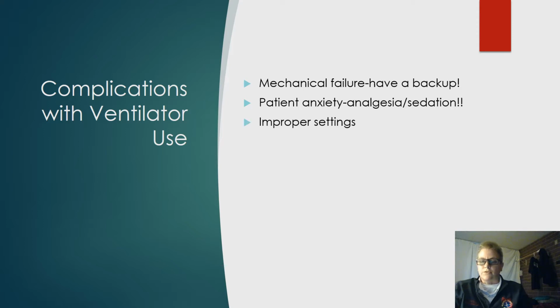Improper settings. So giving too low or too high a tidal volume can cause massive complications, as well as too low respiratory rate. Are we making our patients hypercarbic or hypocarbic just due to our settings? We can't cause more problems.